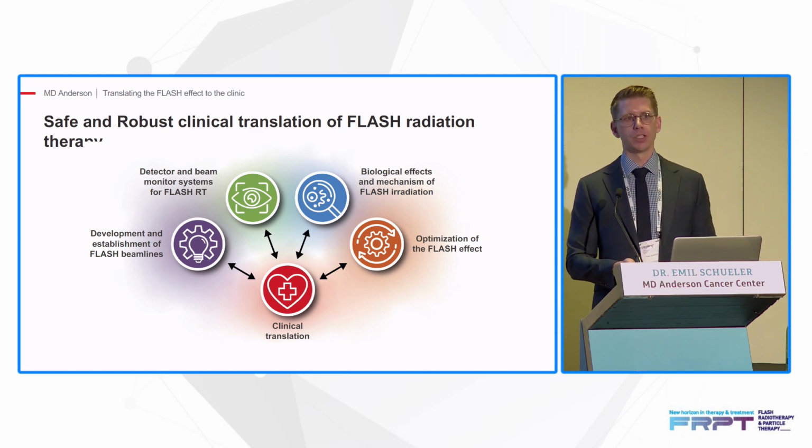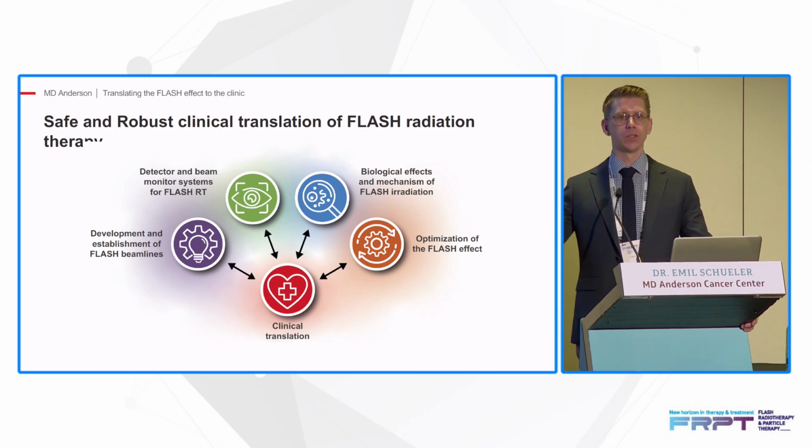Detector and beam monitoring systems, which I just talked about. Biological effects and mechanisms, again, to elucidate what we need to do in a treatment planning system or in a beam control system. Radiation biology is still what needs to inform us of what to put importance on there.